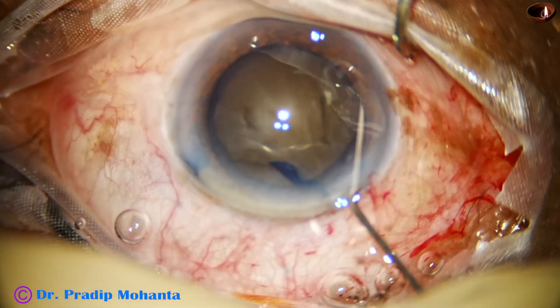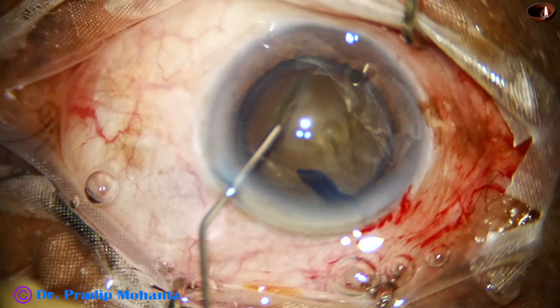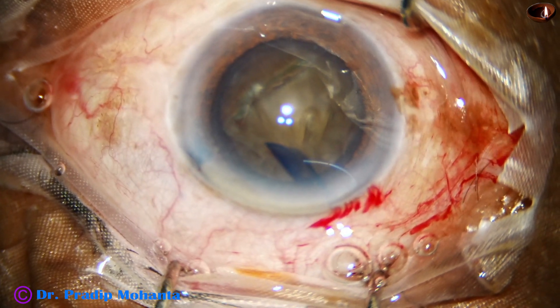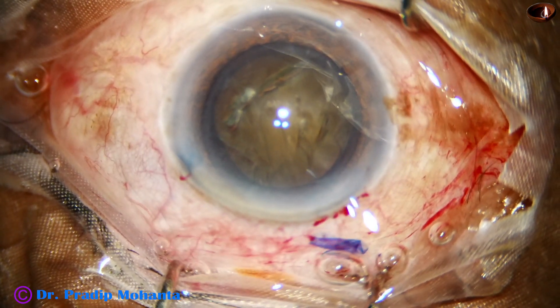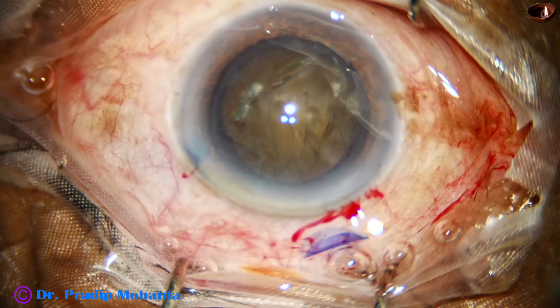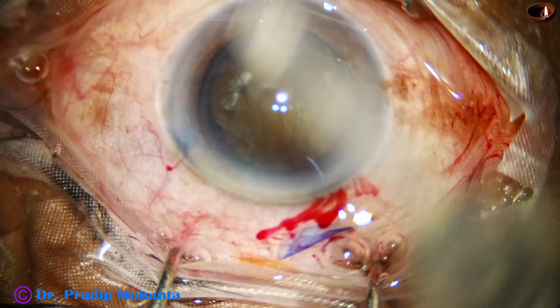Now, hydrodissection is done at multiple points and the nucleus is tapped. And now, I rotate the nucleus. Sometimes I rotate bimanually, but in this case, I could rotate the nucleus just by the hydrodissection cannula.